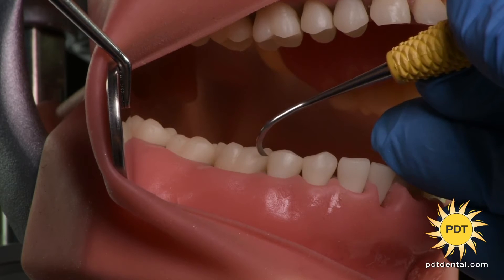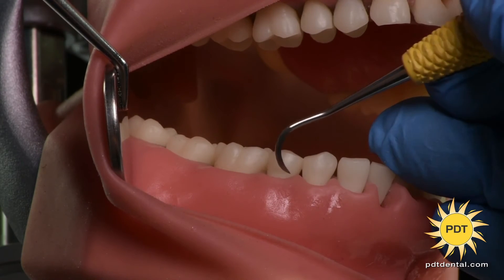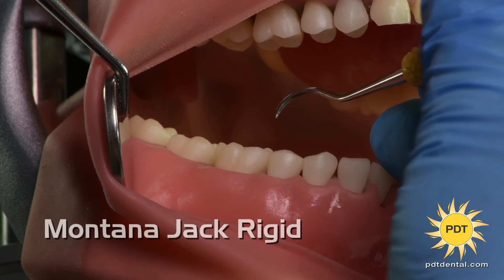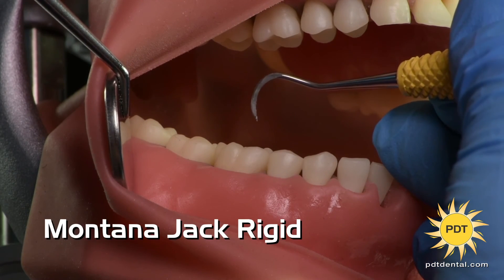Like the original, the unique blade design of the Montana Jack Rigid allows for easier interproximal access with less ergonomic stress on your hands and wrists. The curvature of the blade adapts better to the tooth surface, improving patient comfort.